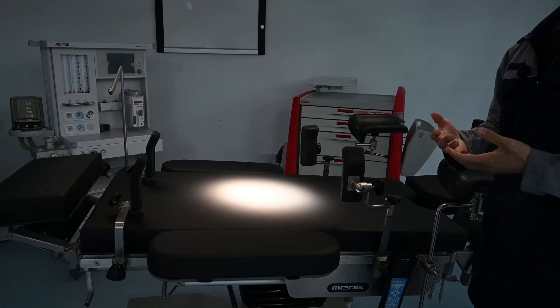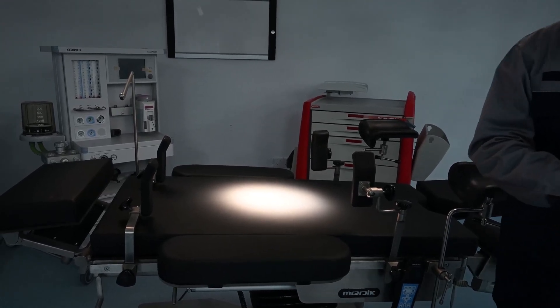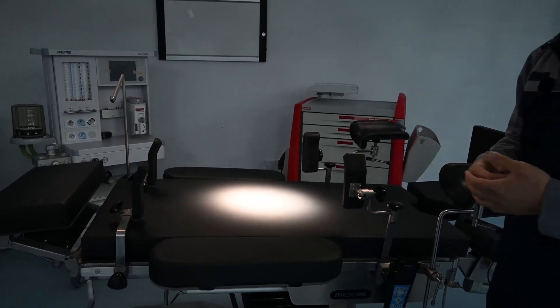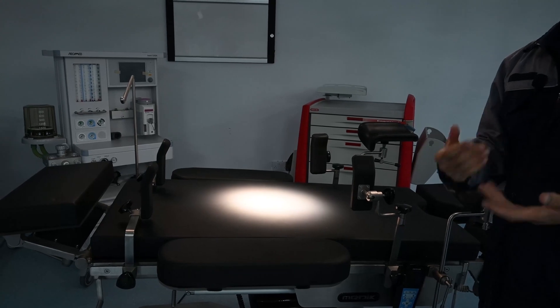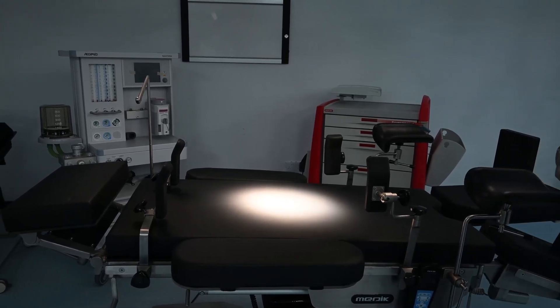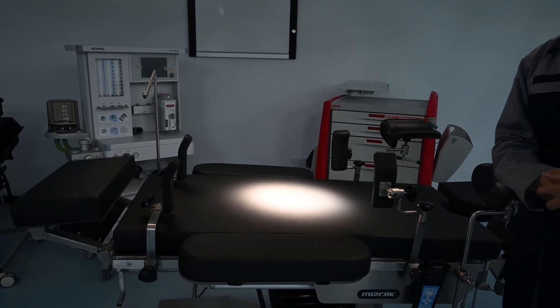It doesn't mean the higher the lux the better, because higher lux will influence the sight of the doctors and make them feel uncomfortable. The normal surgical lux is around 40,000 to 50,000 lux.